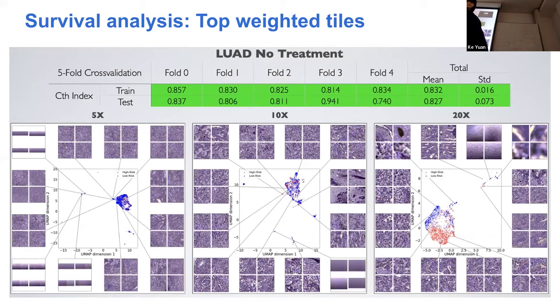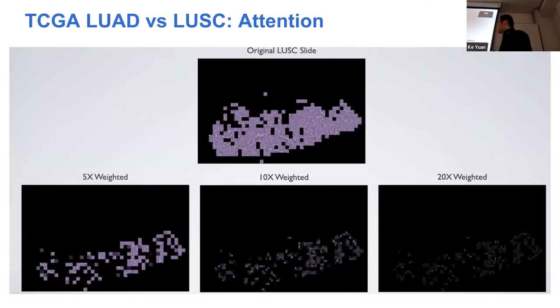These are highly inflated because they overfit this data set. So the logistic problem that I want to talk about is that you lose so much information in there. Back to your question, I set out to understand the diversity in the image. Here I'm only retaining 5% or 10% of the image. I lose all that information.